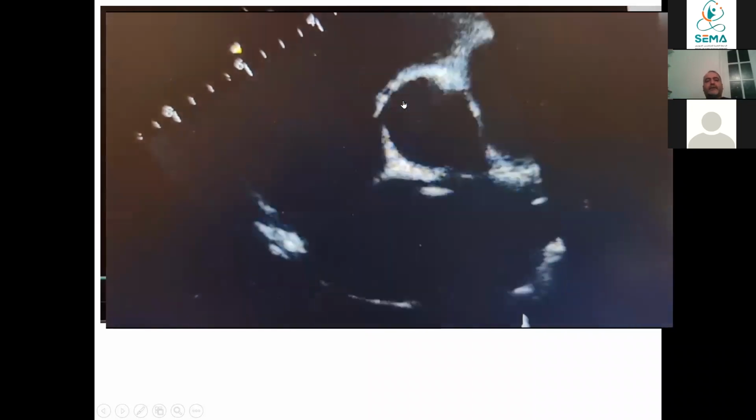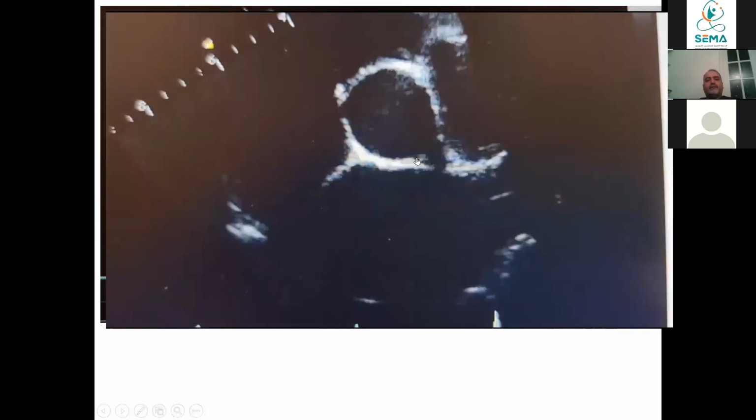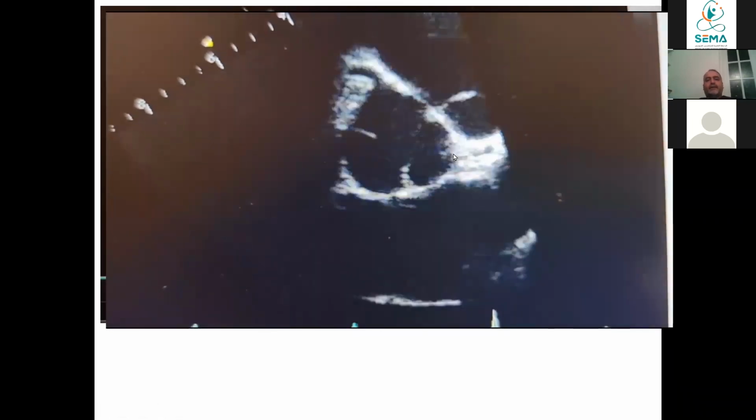When you look at it, you see if there is any dilatation or anything. Even from this view, you can still see the LCA, left coronary artery, here. This is a benefit later on in Kawasaki disease to see dilatation, but also important to know if the right and left coronary arteries are coming from the correct place or from another place, just to know the anomalies there.